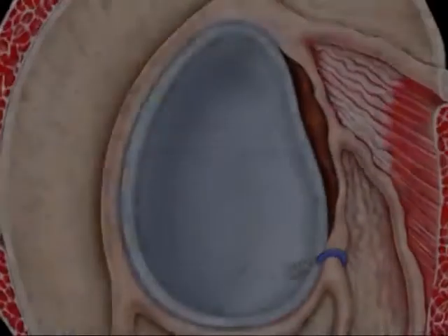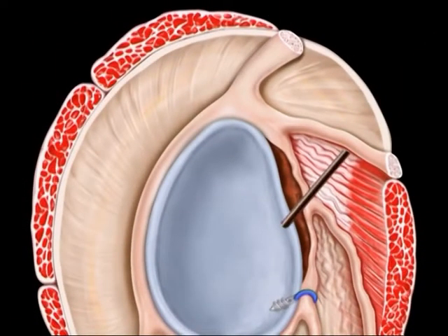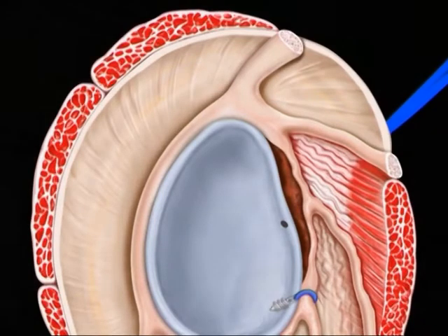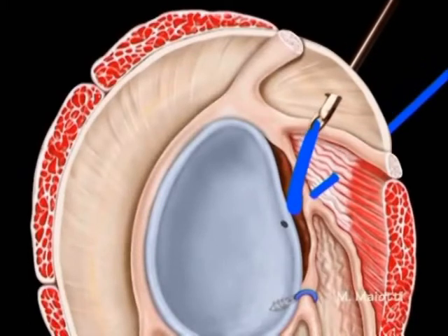The suture anchor bone hole is placed on the anterior glenoid edge at three o'clock from the lower cannula. The middle articular portion of the subscapularis tendon, and if present the glenoid labrum, are perforated with a penetrator punch. One of the free ends is then pulled out from the upper cannula with a suture retriever.